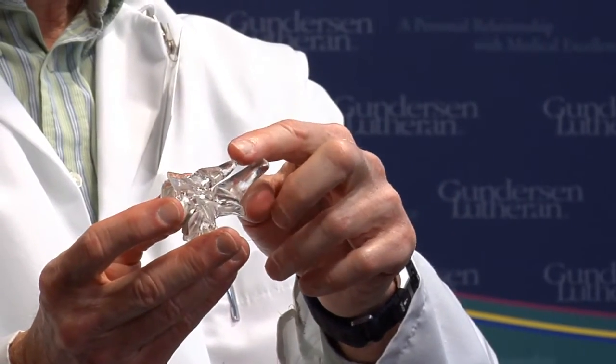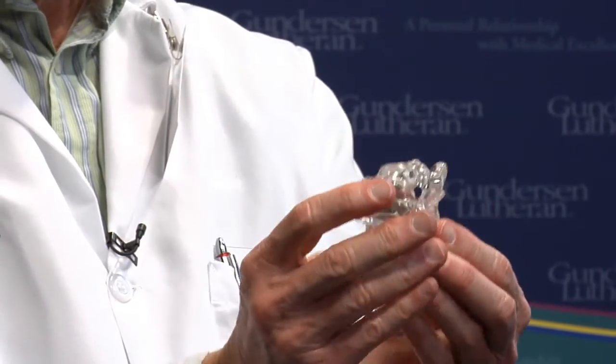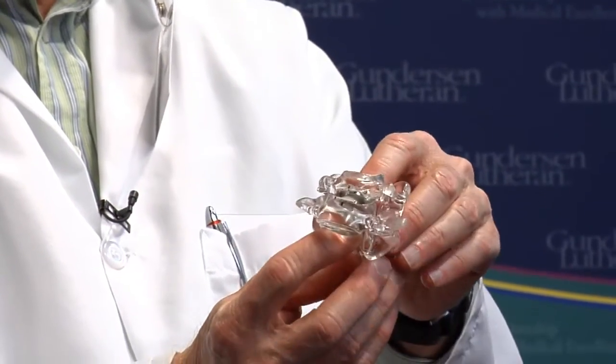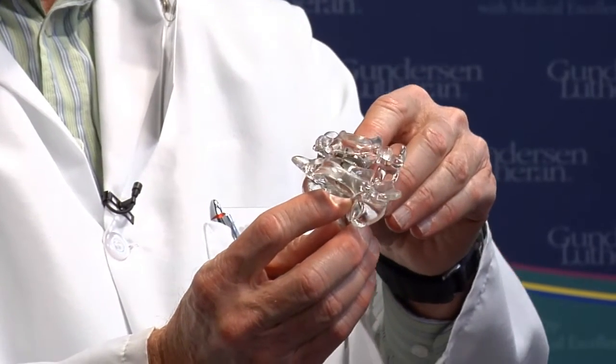As in the lumbar spine, this would be the little bumps you see on the back of your neck. This is the front of the spine, and you can see that the prosthesis allows a very normal range of cervical motion.